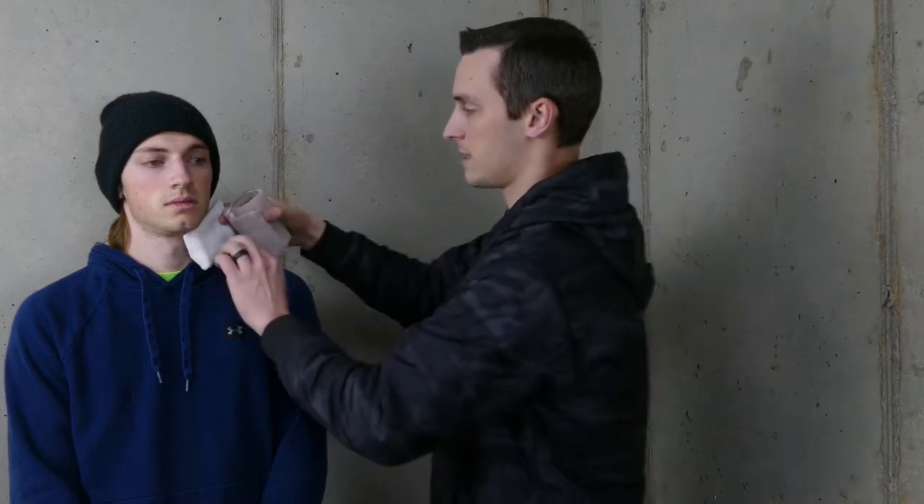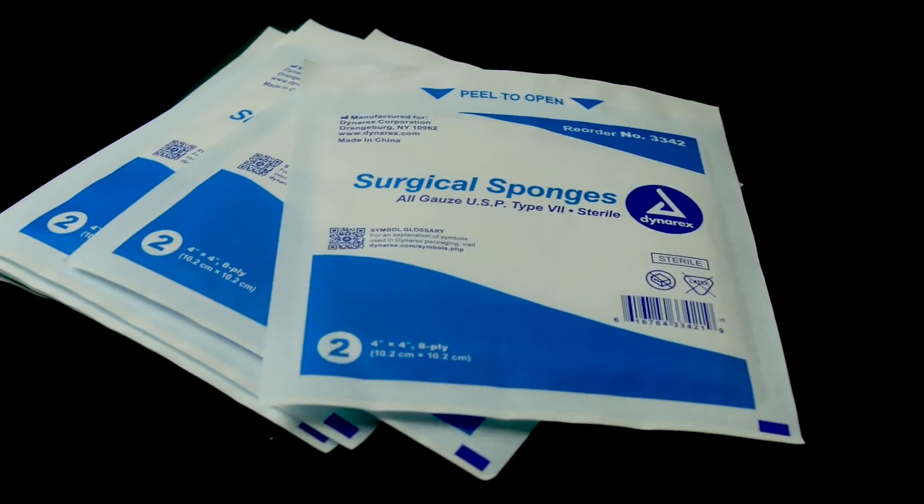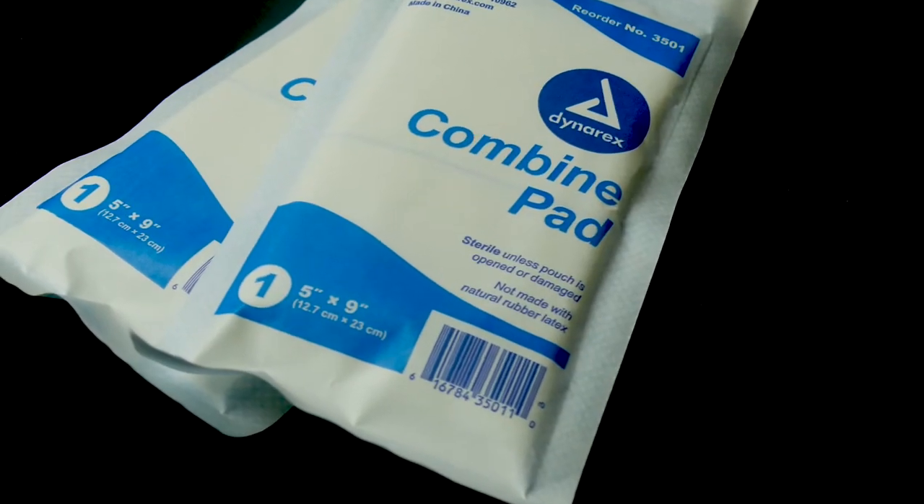The difference between a bandage and a dressing: the dressing actually goes directly on top of the wound. That's going to be something like this 4x4 gauze, or a combine pad — something that goes on the wound. It will absorb some of that blood and help keep the wound clean so no further dirt or debris gets in to cause infection.